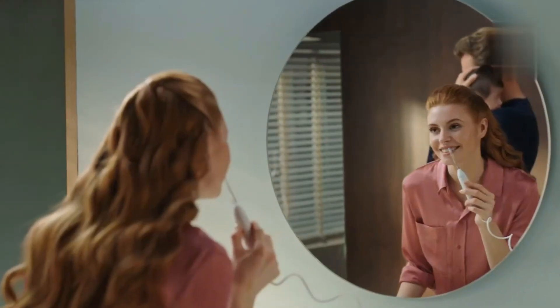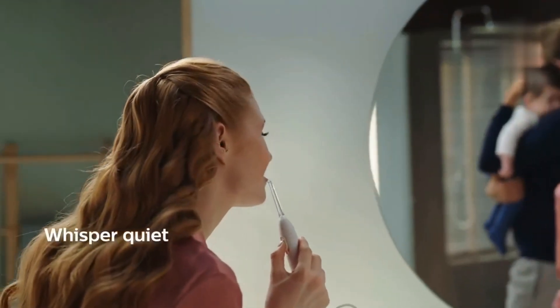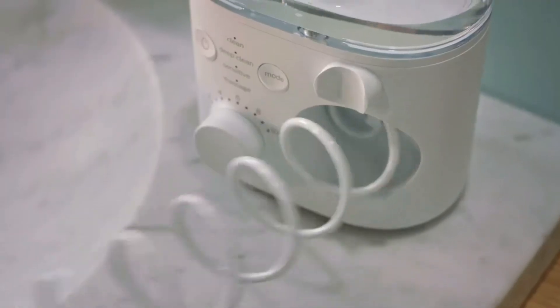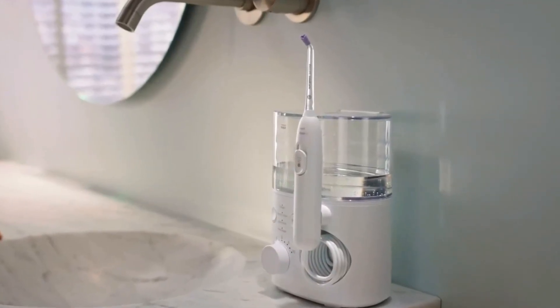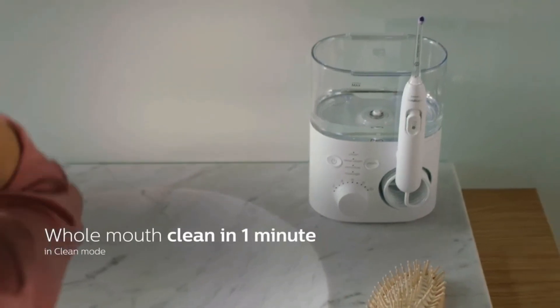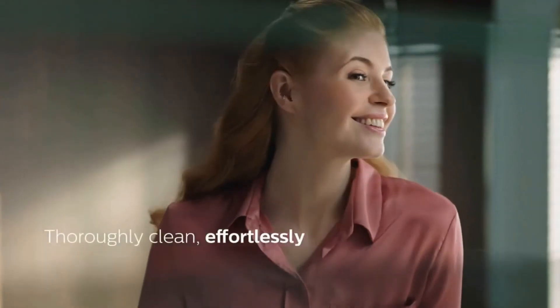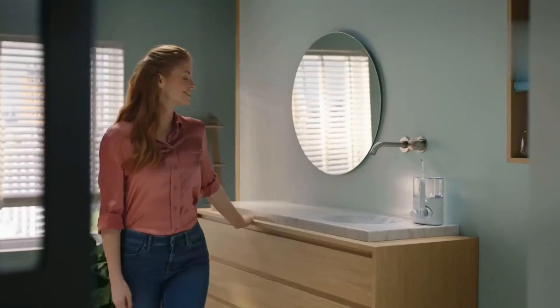With the longest hose among the models we tried — a 3-foot, 9-inch retractable cord — plus a magnetic handle, it's easier to navigate and store. Reservoir fills come easy with its flip lid. Plus, if you value counter space, testers preferred its sleek design compared to the clunkier water flossers.